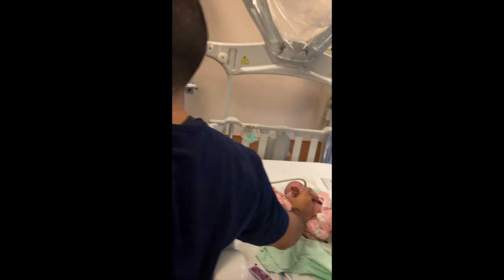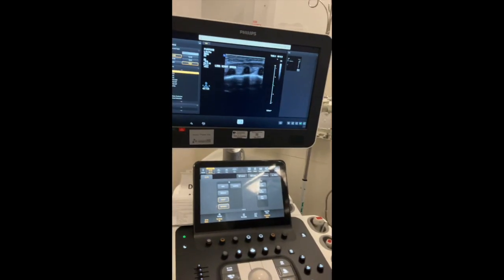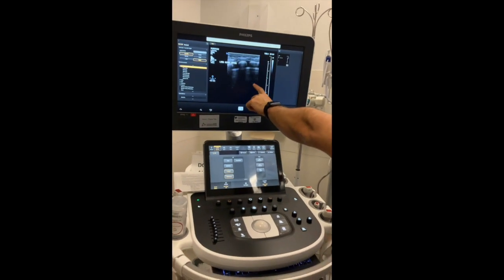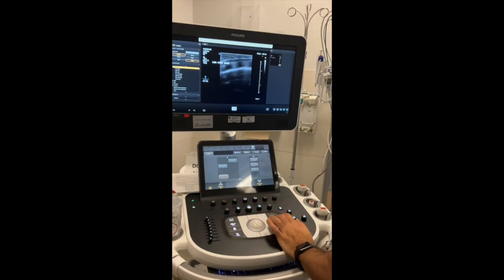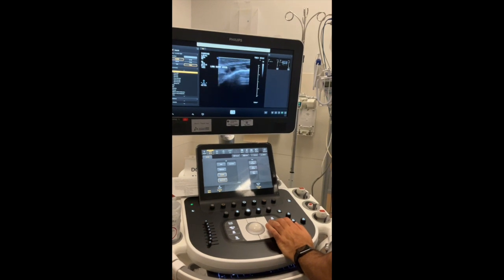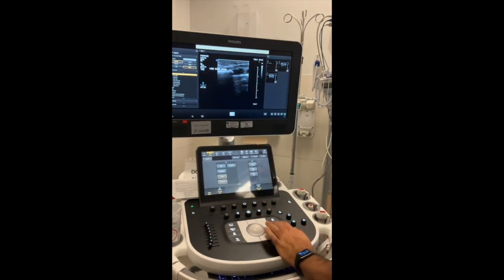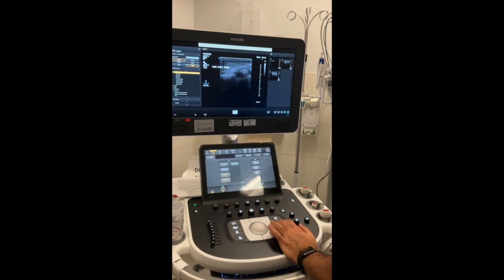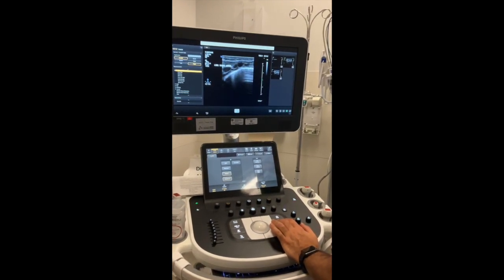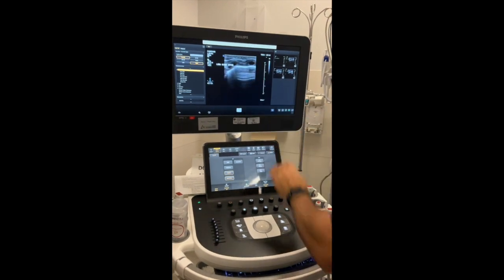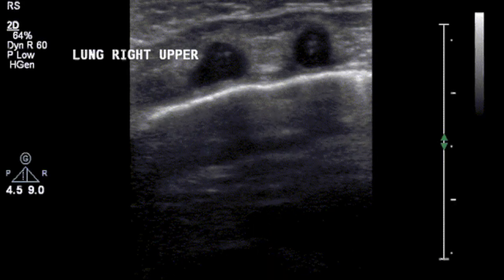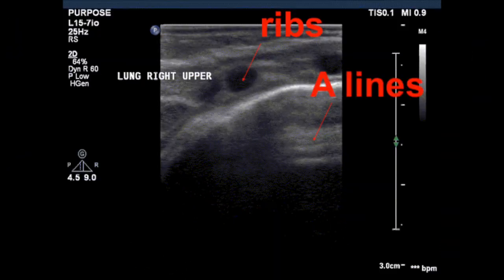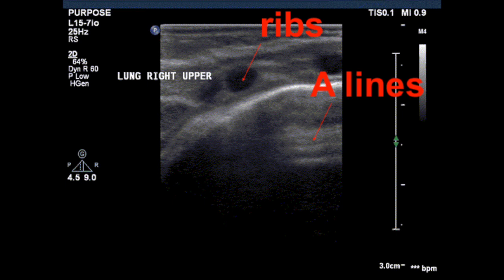Here we can see the ribs and we can see the A-lines. I'm going to acquire. We can see the pleura, and as we have five seconds of breathing in the mid-clavicular line, I acquire where we see a lot of A-lines. This is what we see on the lung ultrasound for the right upper lobe — the ribs and A-lines.